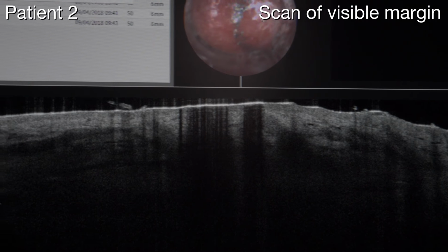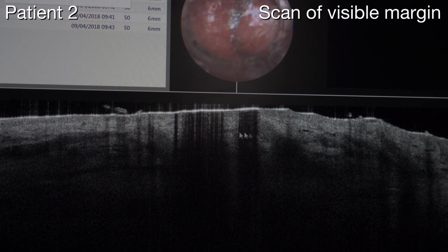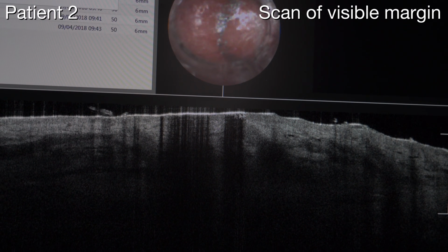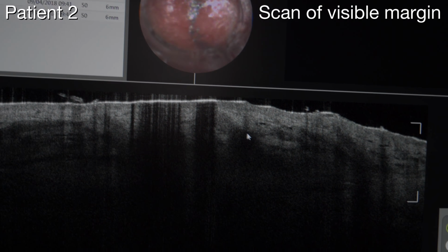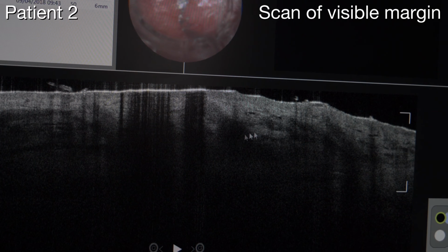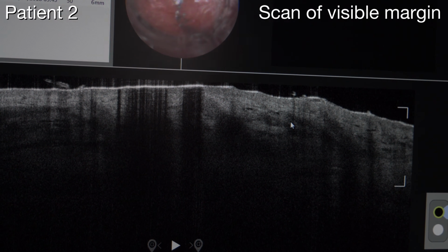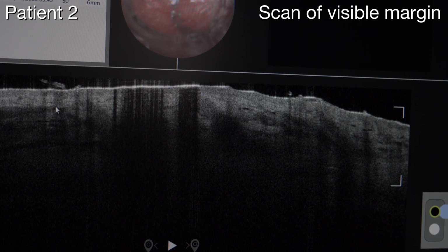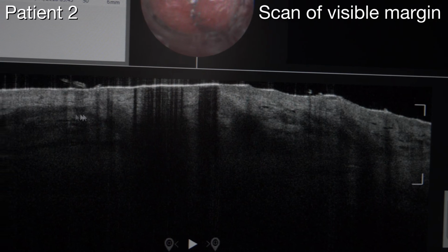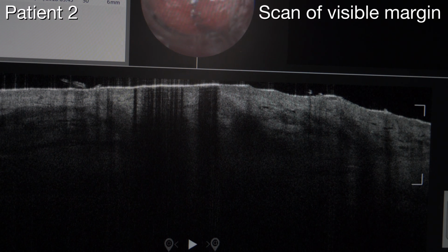Here it is the same. We have here the pen in the middle, here is the shadow, here's the hyperreflection of the pen, and here we have inside the tumor. We could imagine that this might be a structure, or this one, tumor island, but here I'm not 100% sure. It's not so easy to interpret, but this big one is a blood vessel. We also had the blood flow visible when we had dynamic flow on, so it was clear that this is a big blood vessel.